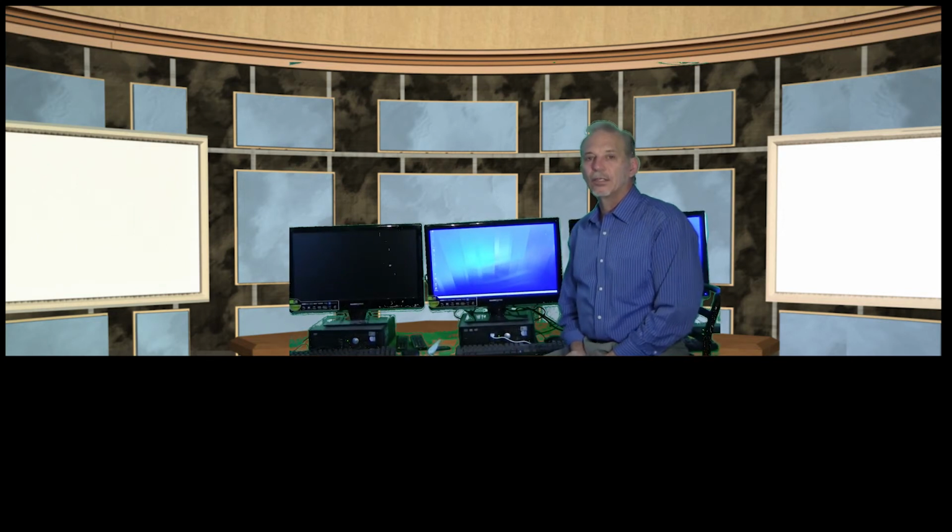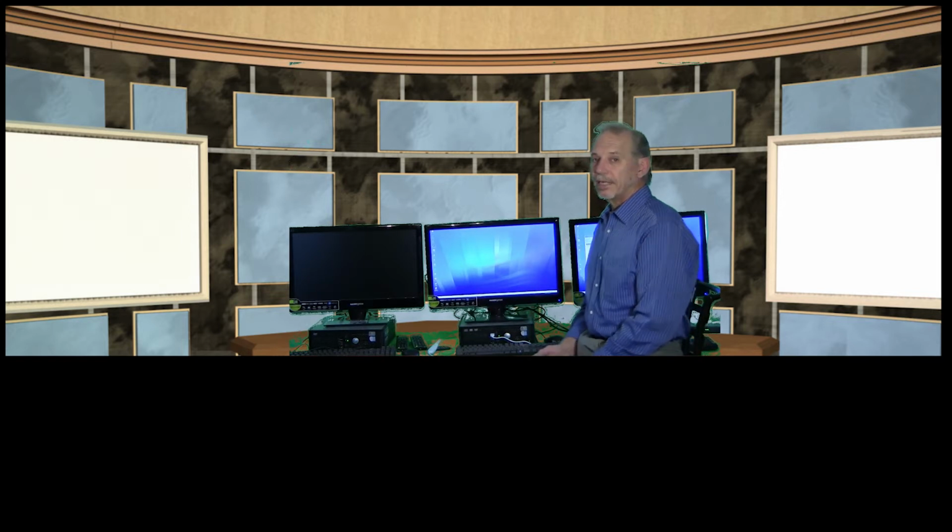Okay, today we're going to take a look at our 3-op camera network. Our 3-op camera network consists of 3 intraoral cameras, 3 Dell Optiplex computers, Dental Eye software, and 3 TV monitors. We'll go over each component right quick so that you have a good overview of what you'll be getting.